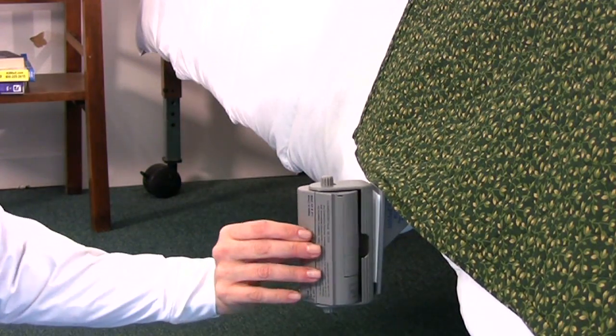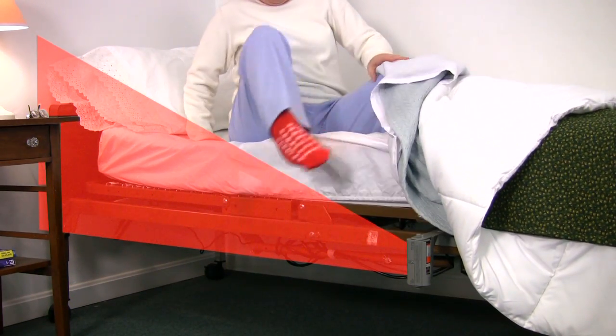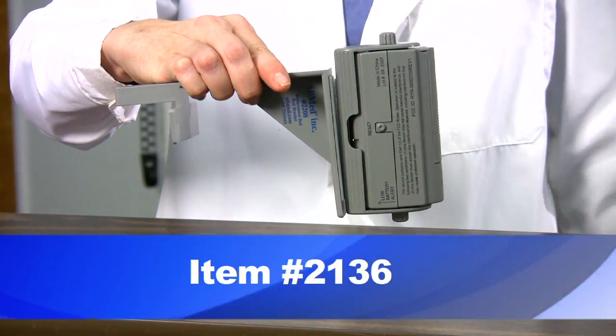To set up the alarm, select a proper mounting location based on the area to be monitored. Position the sensor so that it creates a sensing field nearest where the patient is likely to move first when attempting to rise. Securely mount the bracket to either the wall or bed, making sure the unit is positioned so the reset switch faces away from the patient. This reduces patient tampering and allows easy access for the caregiver. A magnetic mount is also available with the purchase of the magnetic bed rail clamp PIR system.